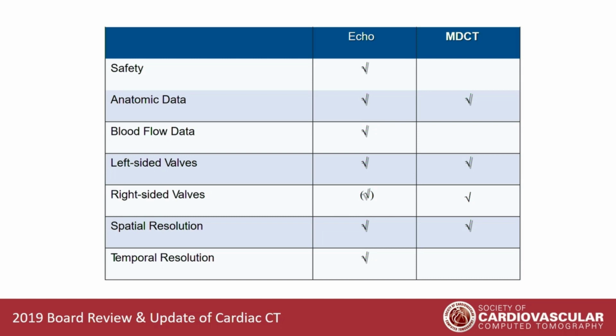So both of those groups get a check mark. Blood flow data, at least as of the current moment, we can't generate flow information on CT, right? So obviously echo wins that battle. You probably are aware that there is some idea that there may be some things we can do for the evaluation of flow data using CT, but right now it's still in the research realm.